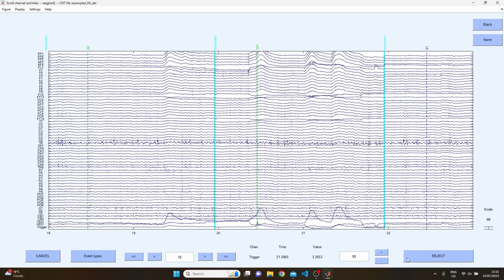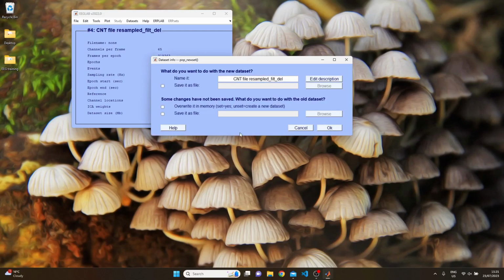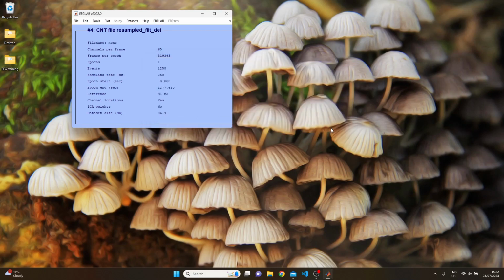Once you've done all this, press reject and save the dataset as whatever you want it to be saved as. For me, if you're following the tutorial step by step, you'll save the dataset as P1 pre-proc1. I use this label to keep track of which stages of the pre-processing pipeline the dataset has undergone. It's important at this stage to save the dataset because this is the dataset we're going to call when we run ICA.